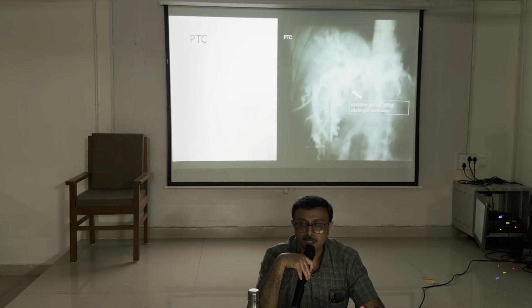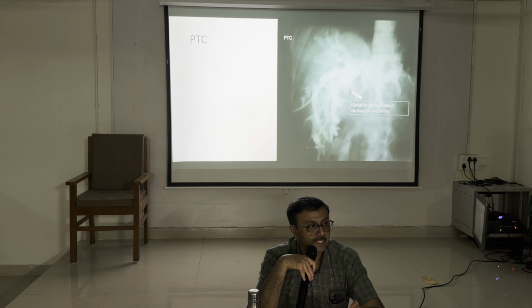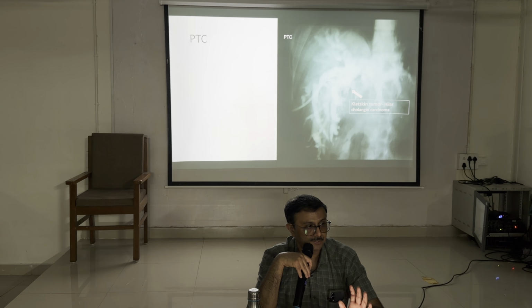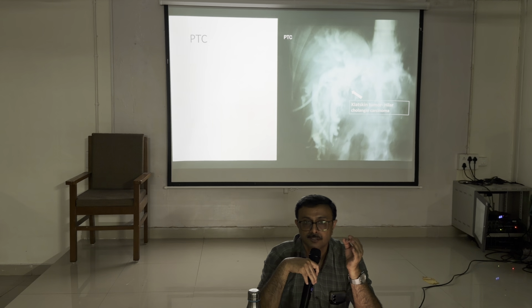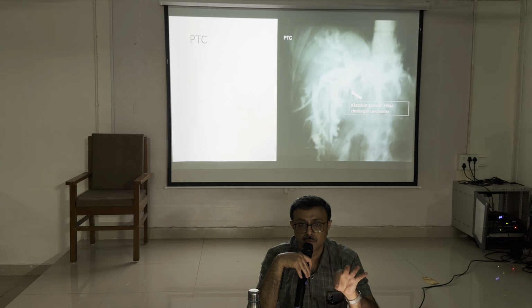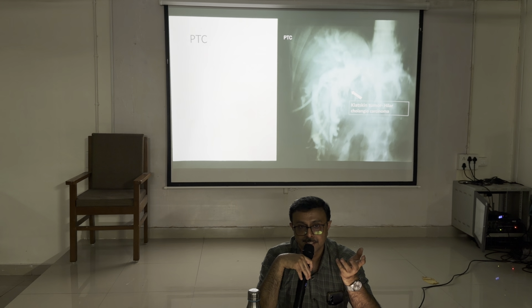Percutaneous transhepatic cholangiography, PTC. PTBD is percutaneous transhepatic biliary drainage. This is investigative cholangiography. We cannulate the hepatic duct through the liver parenchyma, transcutaneously, and inject dye, and then we can see the biliary tree.